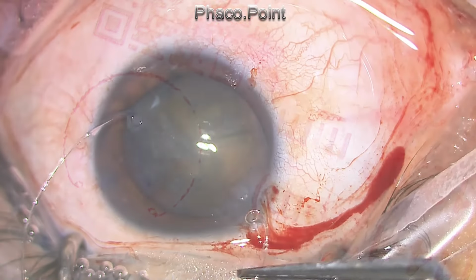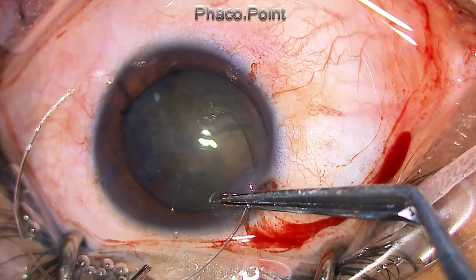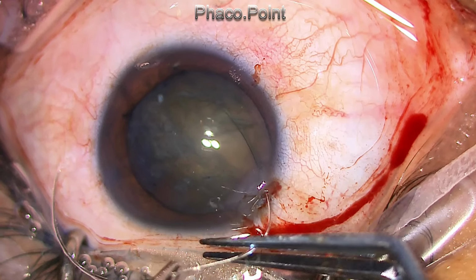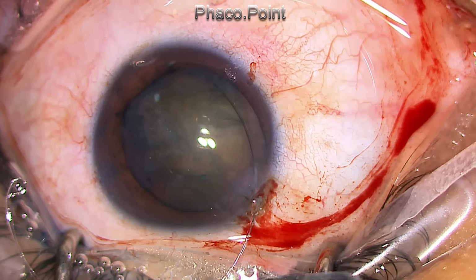So these are two successive cases, and in both the cases I'm putting the capsule tension ring in at the beginning of the procedure, even before I start any of the procedures, and you see that in both the cases CTR implantation is successful. This is not just by luck or chance.